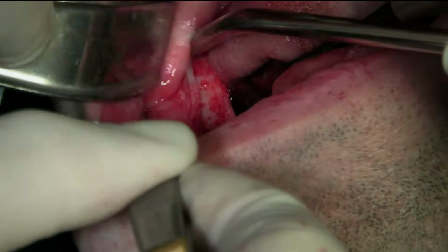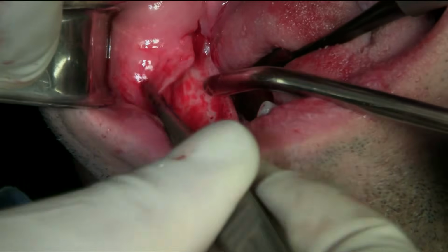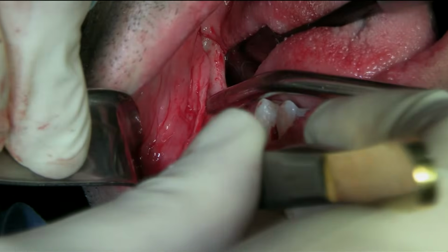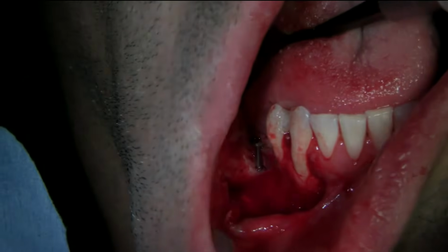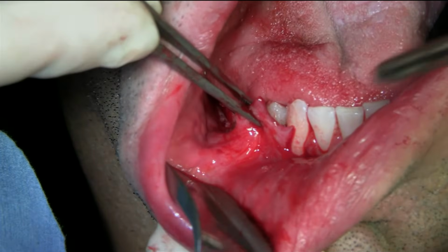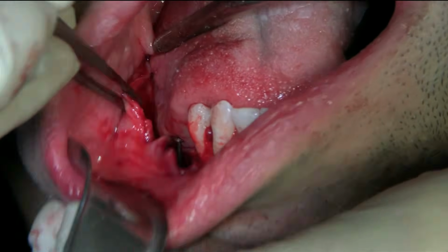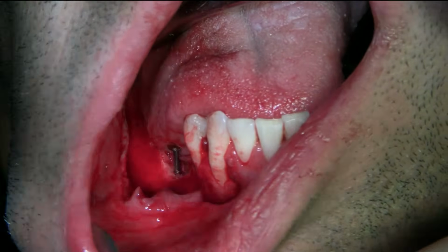And I still got room to go. But it seems to be already completely loose. So I'm going to release a little bit more the posterior. Anterior where the mental foramen is looks really good. So, you see I can bring the flap all the way coronal to my tooth position. Okay. Let's see this one.